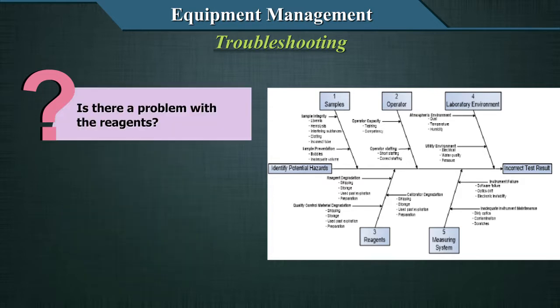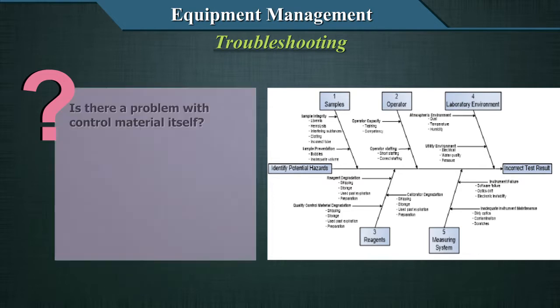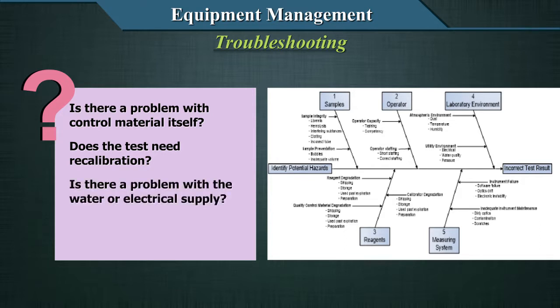Is there a problem with the reagents? Consider storage, expiry, and updating of the new lot numbers of reagents with calibration. All those things should be looked at as part of the troubleshooting. Is there a problem with control material itself? Does the test need recalibration? Is there a problem with the water or electrical supply? Environmental problems such as temperature outage?